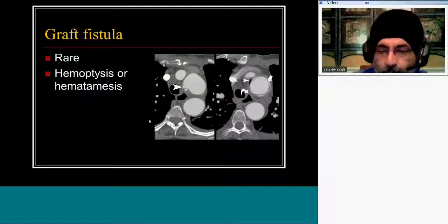Graft fistula is actually very, very rare. I have never seen it. This is from that same article in Radiographics.